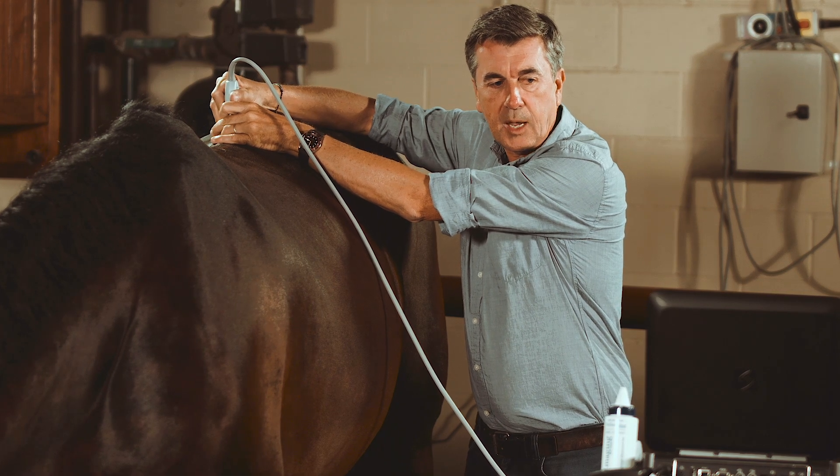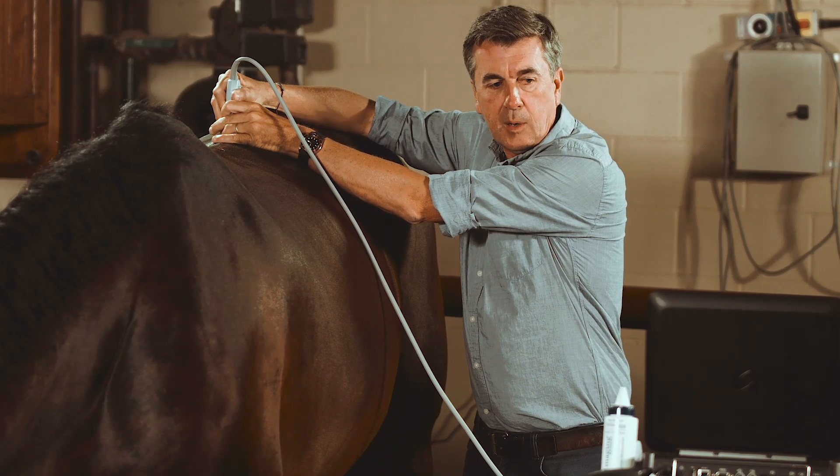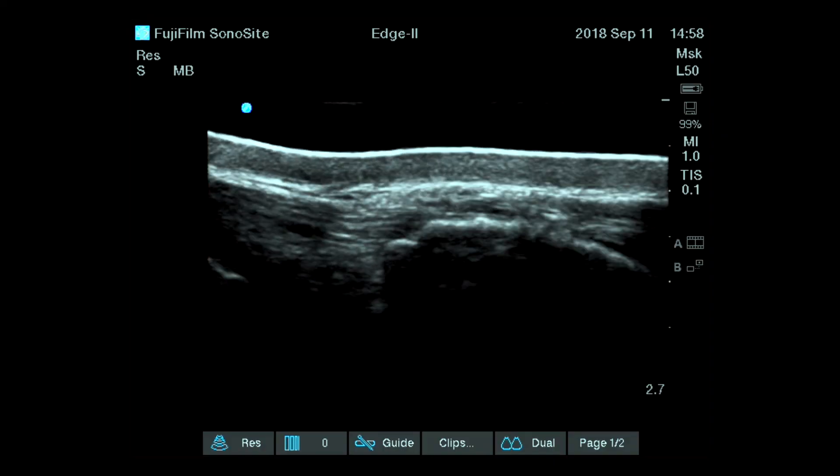This horse is interesting because we have reference images and at the same time we have some minor findings on the superficial aspect.